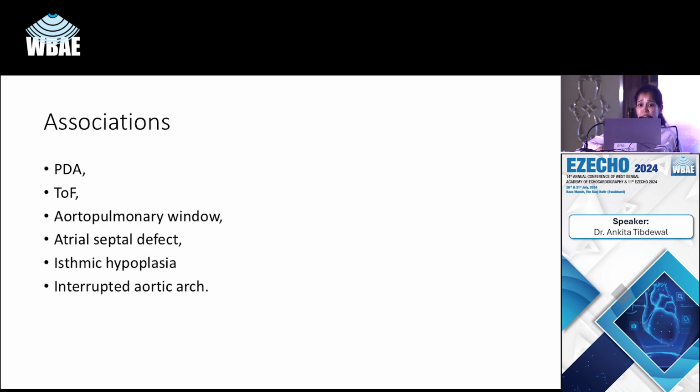So in our patient, since the LPA was arising from the RV, the entire systemic circulation was being directed to the LPA, and as a result, there was progressive pulmonary hypertension in the left lung. And in the right pulmonary artery, since it was arising from the ascending aorta, it was receiving all the transmitted systemic pressure, and that led to progressive pulmonary hypertension in the right lung.